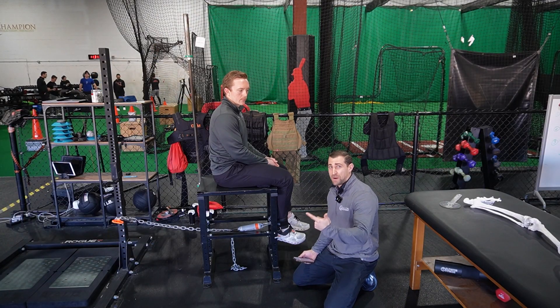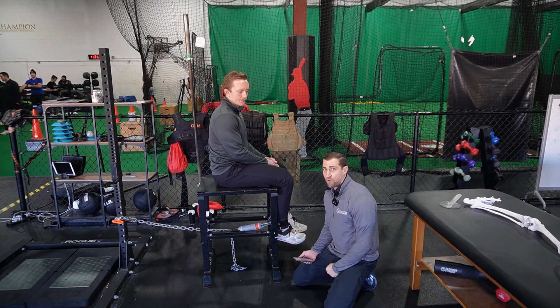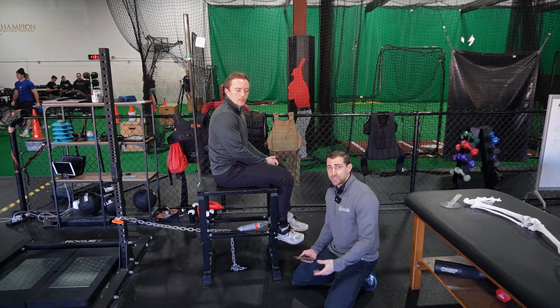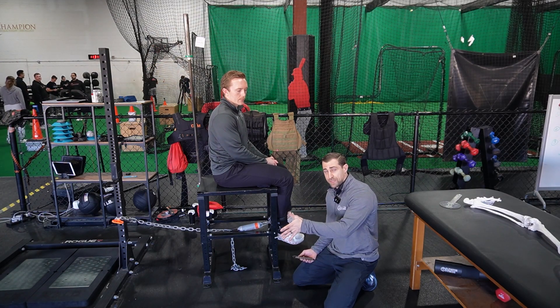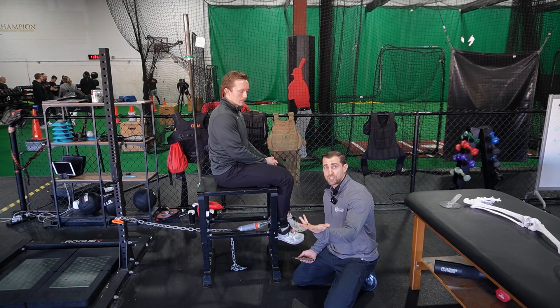You can take somewhere between one to three measurements and either take the strongest peak force or average the three — it's up to you. If we're trying to measure rate of force development, which is basically how fast you produce that force, we want to change our cueing.